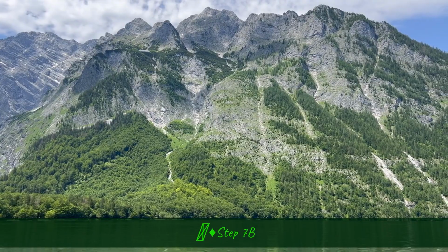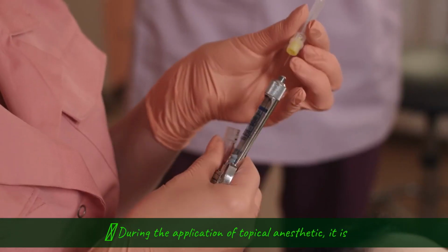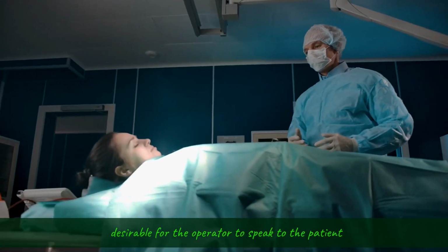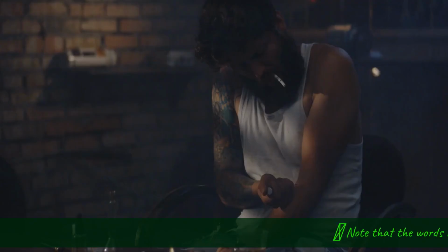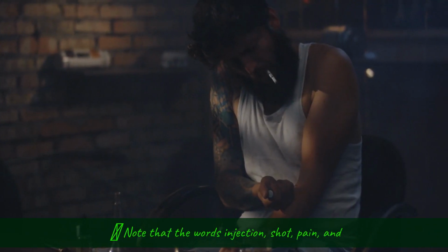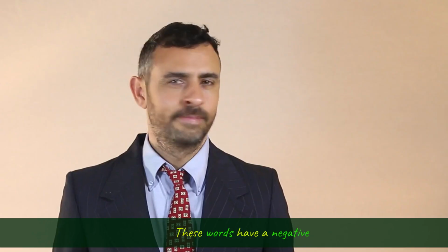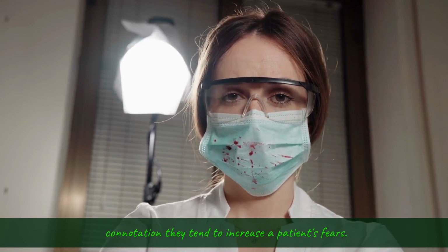Diamond, Step 7b. Communicate with the patient. During the application of topical anesthetic, it is desirable for the operator to speak to the patient about the reasons for its use. Note that the words injection, shot, pain, and hurt are not used. These words have a negative connotation. They tend to increase a patient's fears.